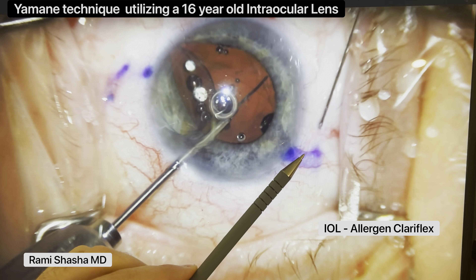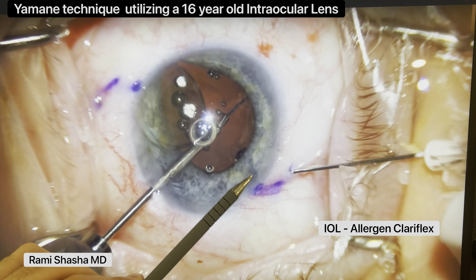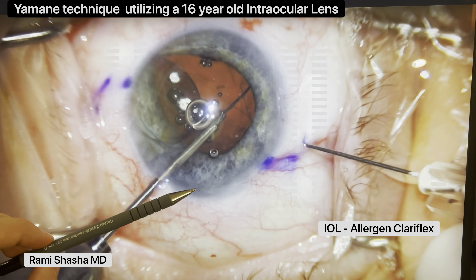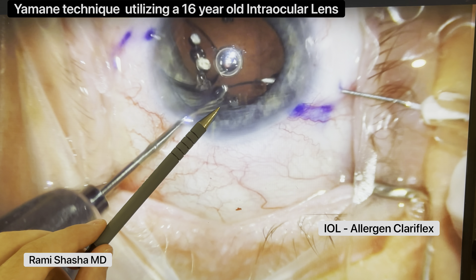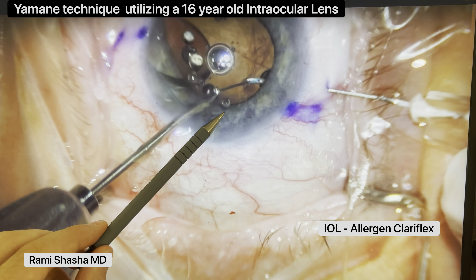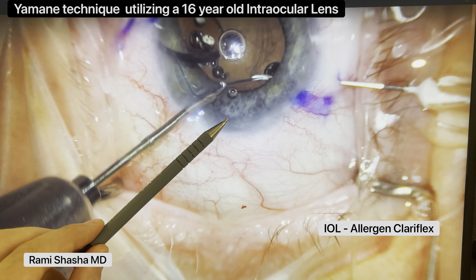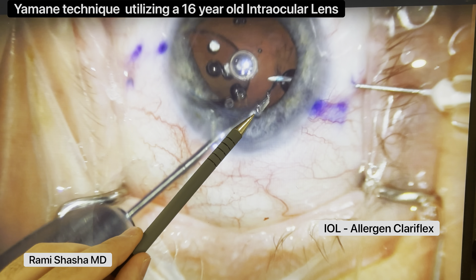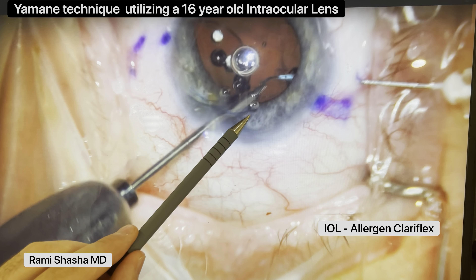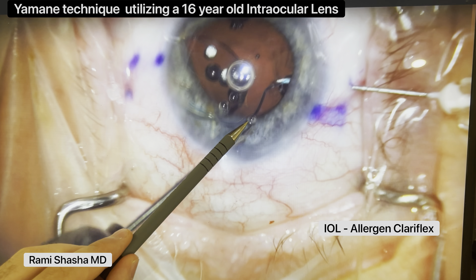Again, 30-gauge TSK needle. Follow the marks and then angle pointing towards the optic nerve. Here you'll see the needle there. The angle here is a little bit more tricky, but eventually the haptic slides. Now, there's a little bit of a kink right there. I actually thought that once that kink happened, the needle wouldn't be able to externalize the haptic.